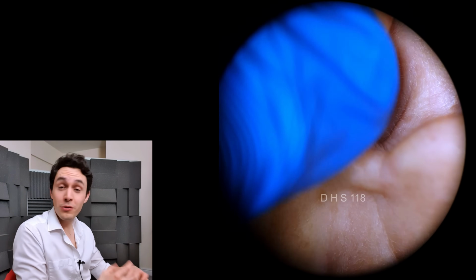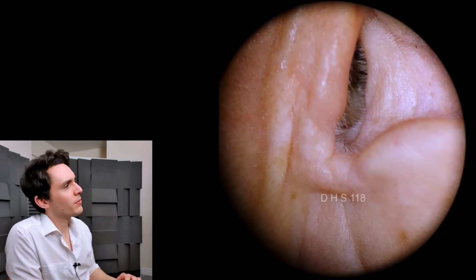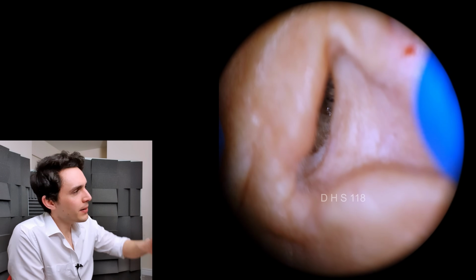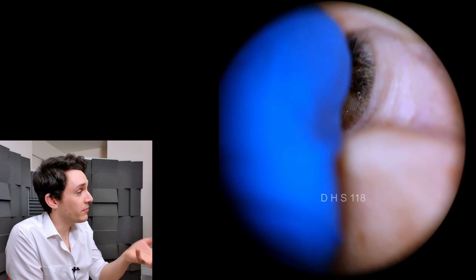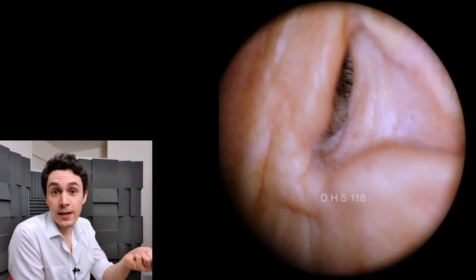Now, out of all the tools that I have in the clinic, suction machines and irrigators and hooks and picks and scoops and so on, this is probably the most unusual looking. It's called an Earway Pro. It is basically a spiral, or an open helix type device, which you put into the ear canal, and then you turn it as you advance it deeper and deeper into the ear.